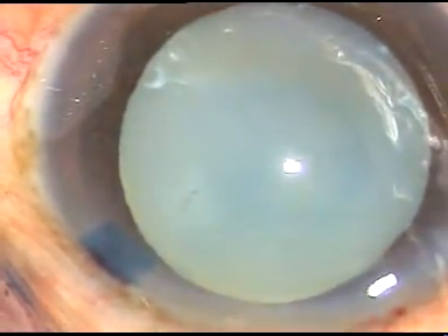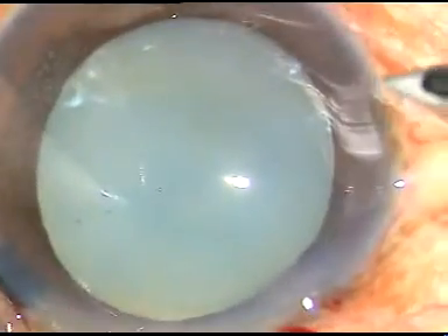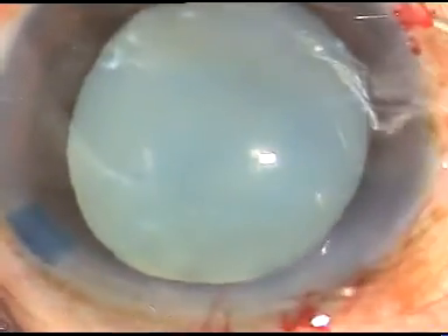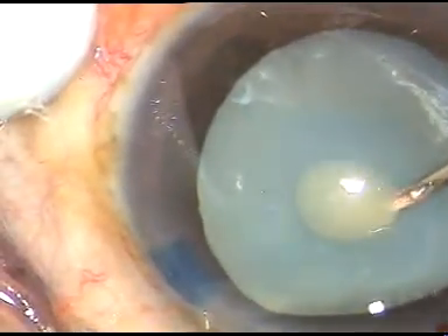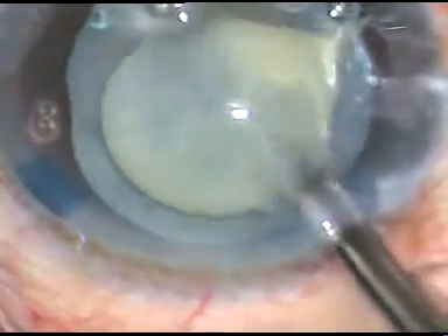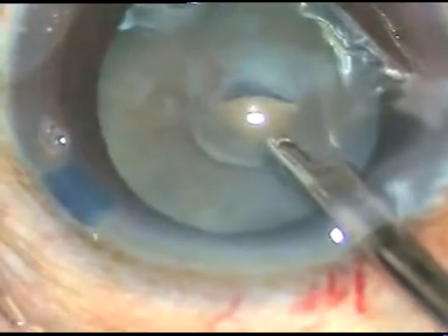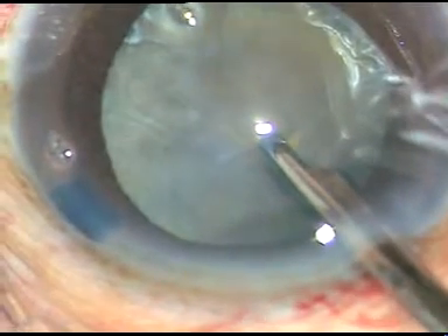The anterior capsule is being incised at the side port. A 26-gauge bent cystitome is introduced and the anterior capsule is incised. See what happens — milky fluid comes out. The milky fluid is aspirated to some extent, and the intralenticular pressure immediately drops.